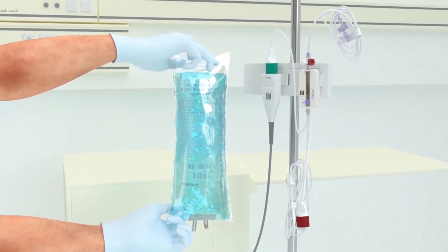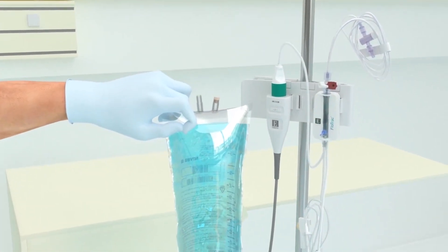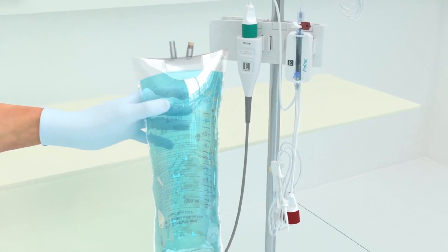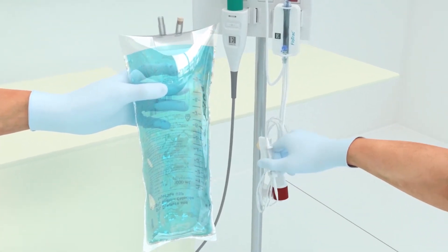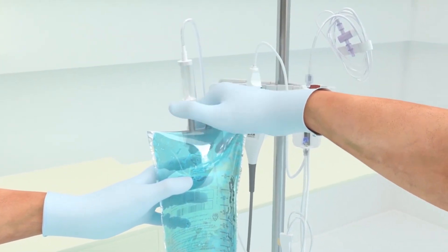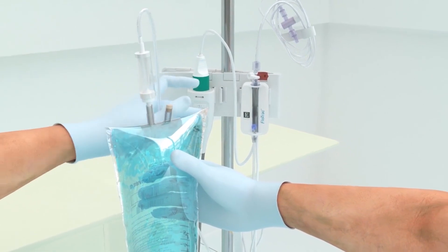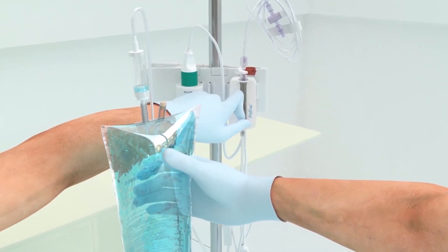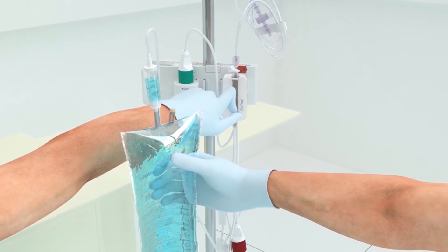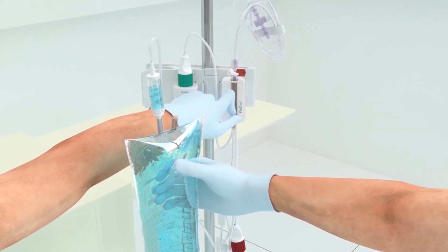To remove the air and prime the FlowTrack system, invert the fluid bag, then spike the fluid bag. Gently squeeze all the air out of the bag with one hand while pulling the flush tab with the other hand until all the air is emptied and the drip chamber is halfway filled. If air is not removed from the bag, air may be forced into the patient's vascular system when the solution is exhausted.